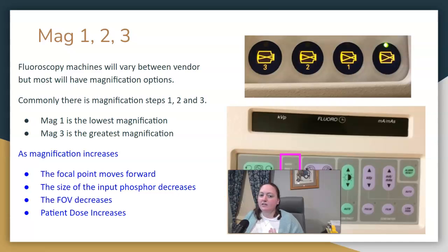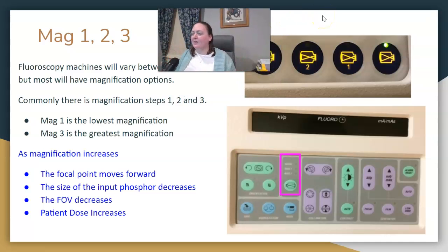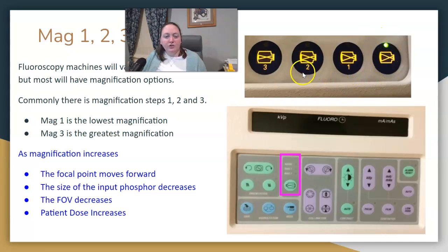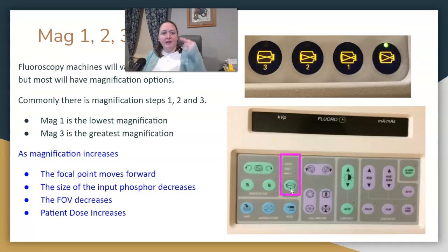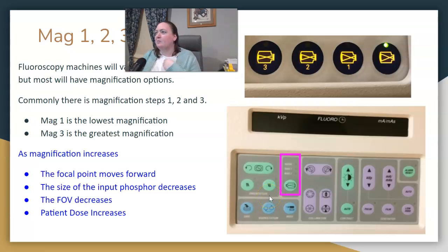Your machines will vary with each vendor, so what your buttons might look like may be a little bit different. On our fluoro machine, we have regular mode and then MAG1, MAG2, and MAG3. On my C-arm, I hit it once for MAG1, again for MAG2, again for MAG3, and to get back to zero I hit it a fourth time. Most of the time there are about three MAG mode options.